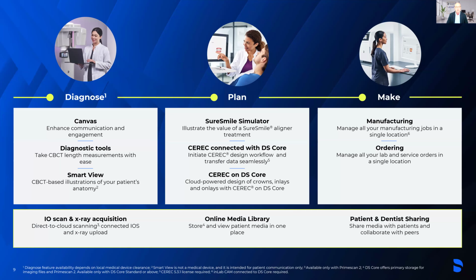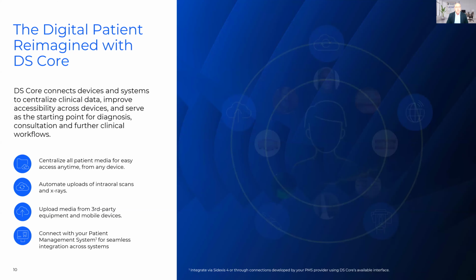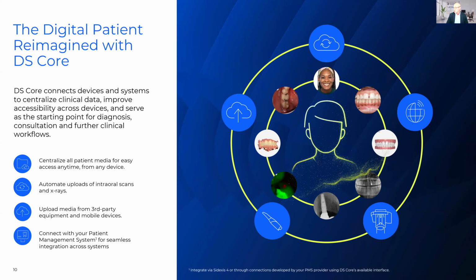Being able to plan your cases from clear aligner cases to your CEREC cases. And then also when it comes down to making your cases, either doing that in-office chairside or ordering from your favorite lab like Lexier. So this whole digital patient experience has been reimagined with DS Core. So everything being brought together.